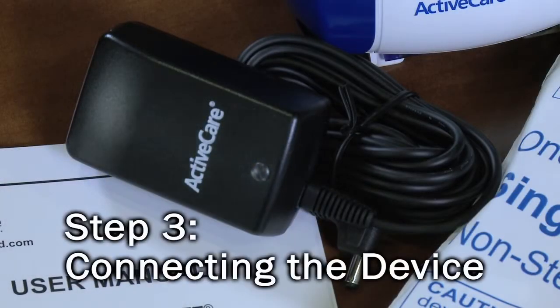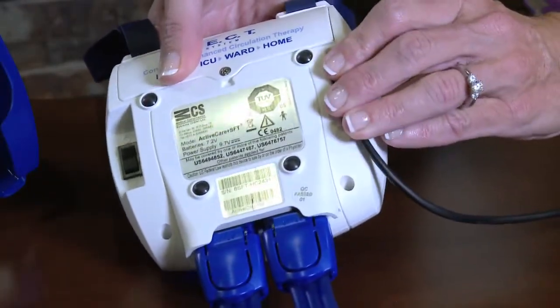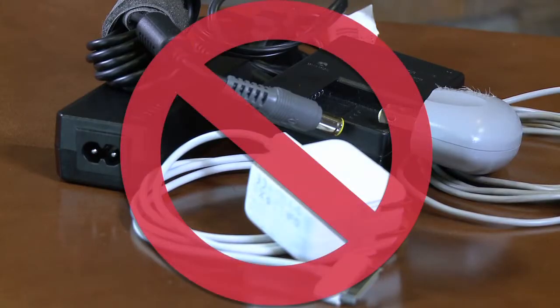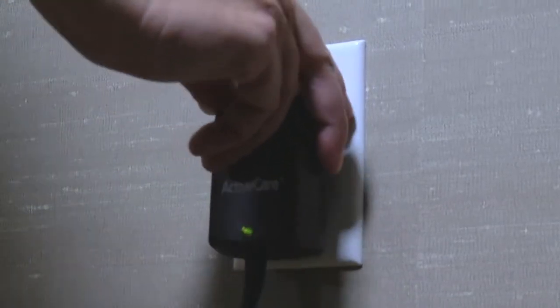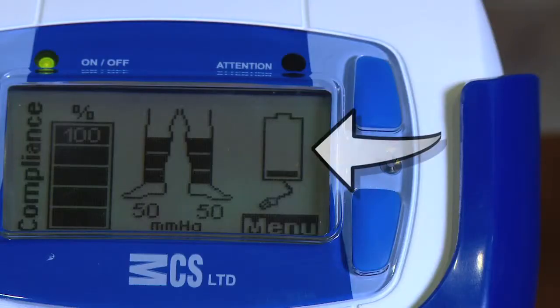Step 3: connecting the device. Connect the AC/DC adapter to the DC power supply jack on the back of the device. Do not use a cell phone, camera, or any other type of charger — only use the adapter that came with your system. Connect the adapter to the main power supply to charge the battery. A screen appears indicating the battery is charging. When the battery is fully charged, the indicator will stop flashing.